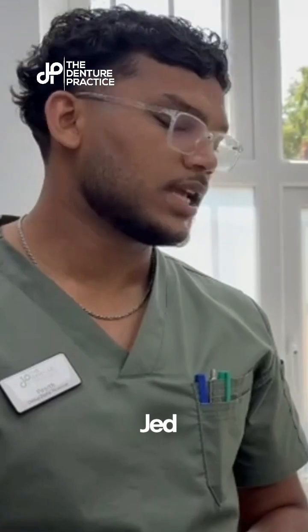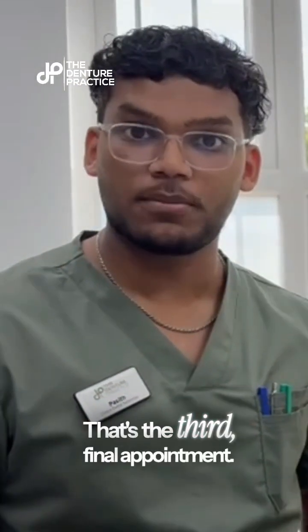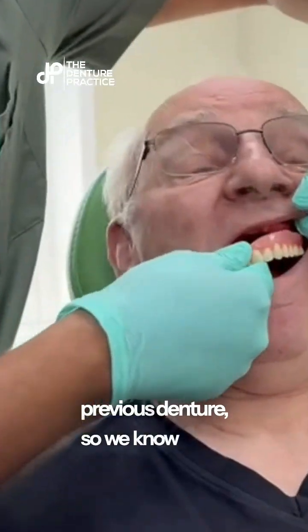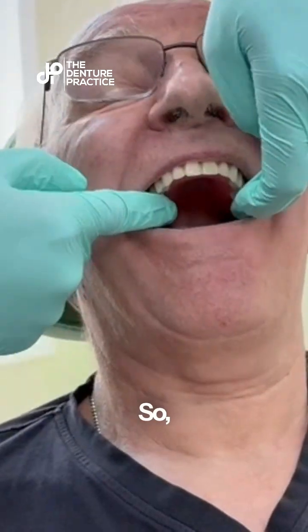We have Mr. Jed back in for his fitting of his denture — that's the third and final appointment. You can see the dentures are fully ready, which have been tried in already with the previous denture. So we know what the patient likes and what he doesn't like, and the patient should be happy with everything from here.